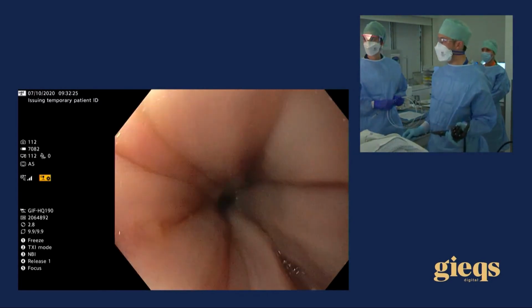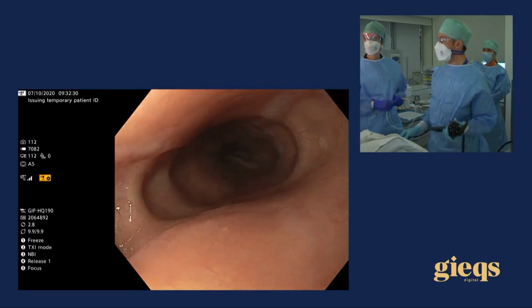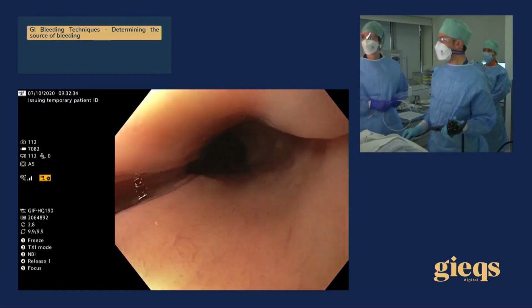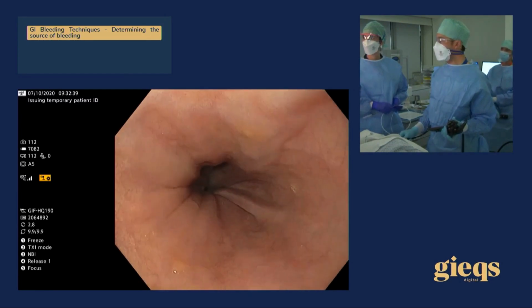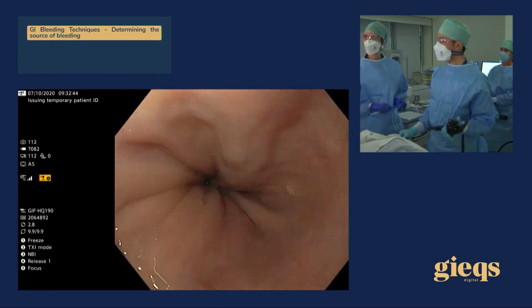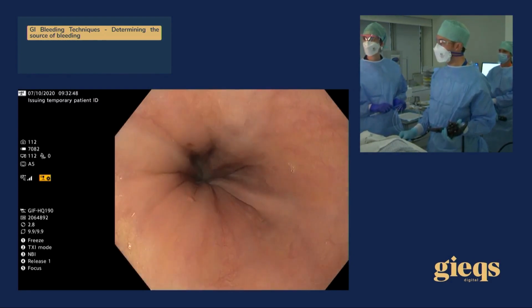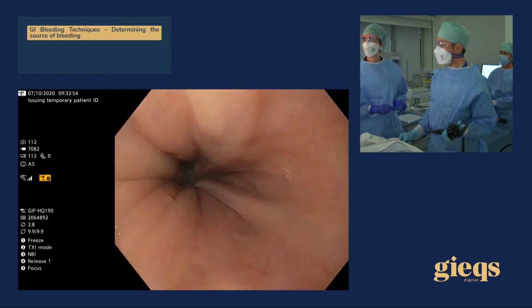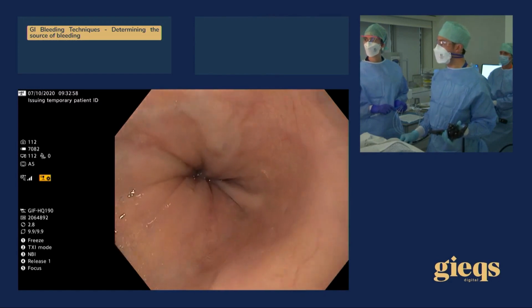And of course, we are indeed, a very good point, interested in looking for the presence or absence of esophageal varices. And of course other lesions, but we've checked there are no other lesions that we're aware of. And so Xavier, what do you think about the appearance here of the distal esophagus? Yes, well, we can see at 1 o'clock there is a beautiful varix present there, but not so many. It's flattening out almost completely when I'm inflating. Would you agree? Exactly. Yes, I agree.